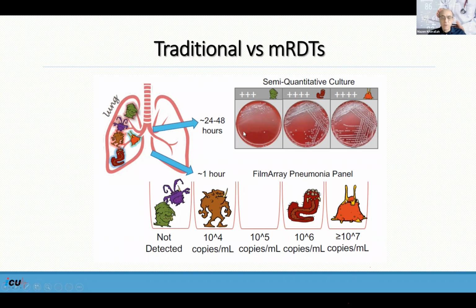We just put them on the tray and we see what's been cultured out. The media that we have on the Petri dish should actually allow for the growth of most of the bacteria, but specific ones would require special media. And this is one of the difficulties of the traditional methods, that you need to select the media where you're going to culture the specimen. Now, with this method, what we do is different.